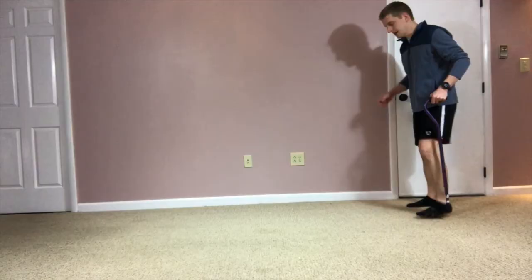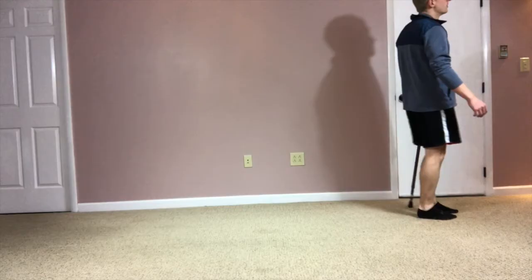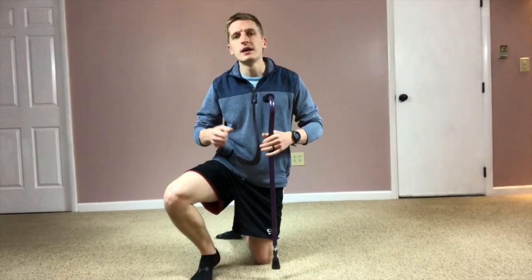Two, one. Two, one. It takes a little practice to get used to, but it can be a really effective way to have some stability, have that little bit of support, but still work on that more normalized gait pattern and walking without having that support of something a little more heavy duty, such as a rolling walker.